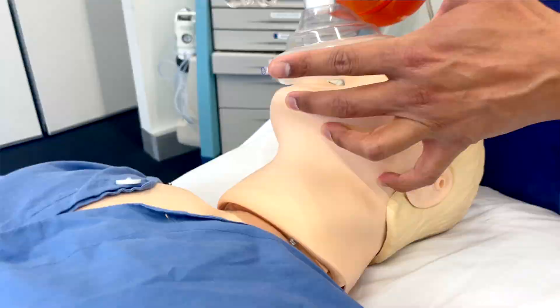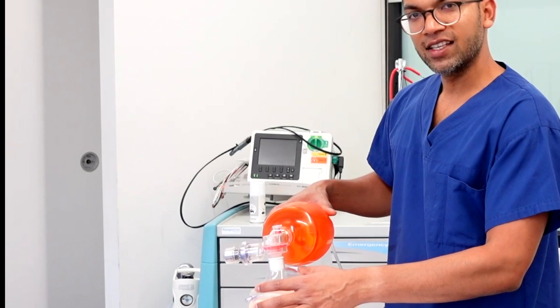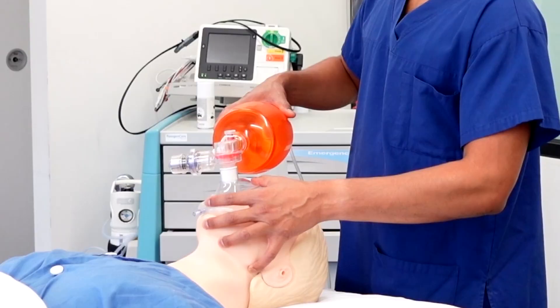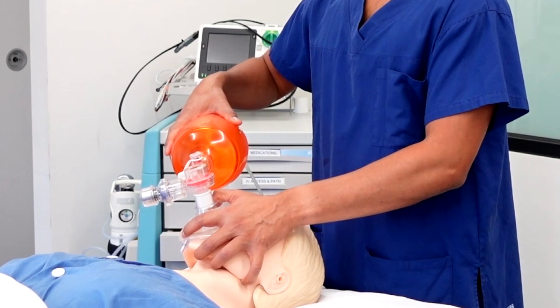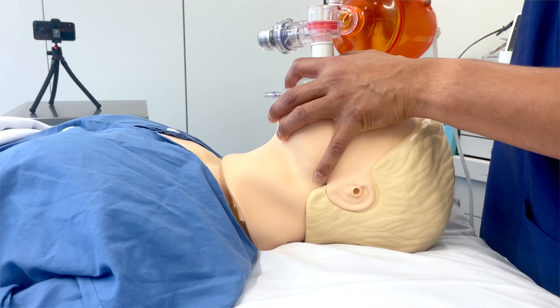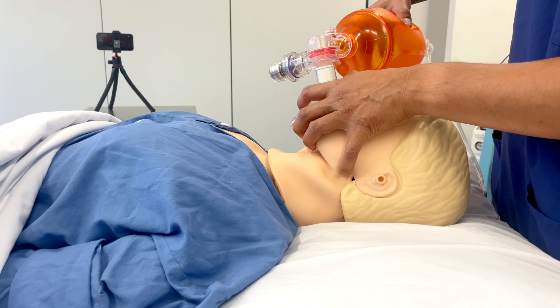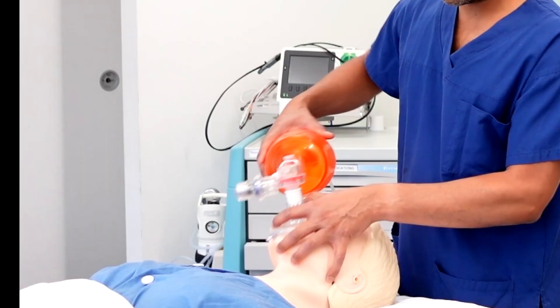Once you've got the CE grip, a really important thing to note is that you want to lift the face towards the mask — you're not pushing down, because that obstructs all the structures. Lifting up opens up the airway and tries to align the three axes, whereas pushing the mask down makes the angle more acute and bag mask ventilation becomes a problem. So remember: lift up, don't push down — that's the CE grip.